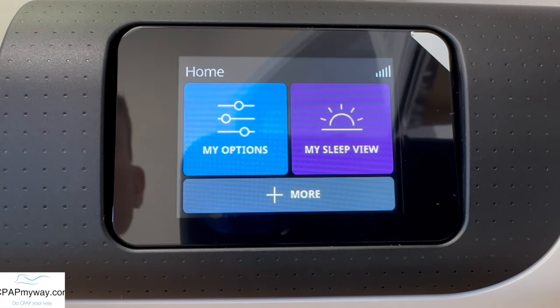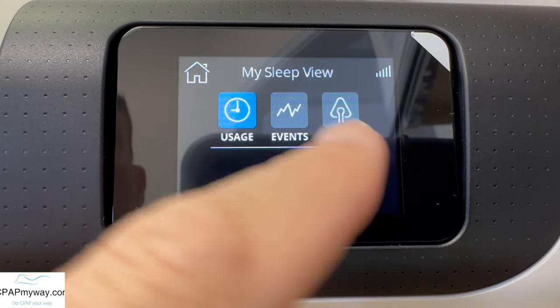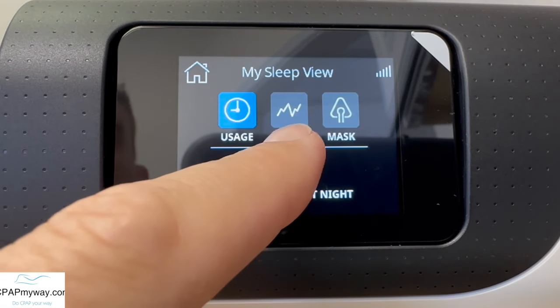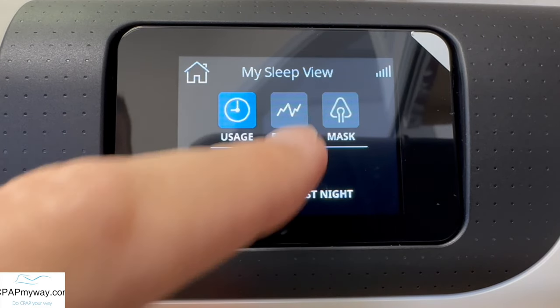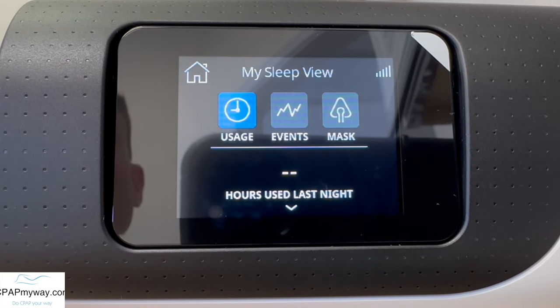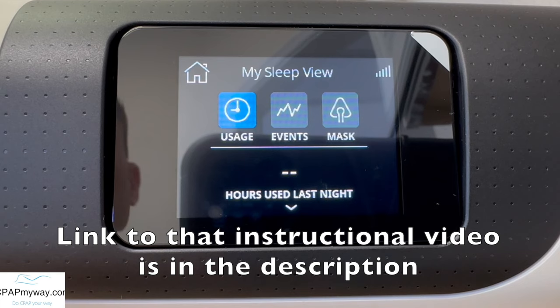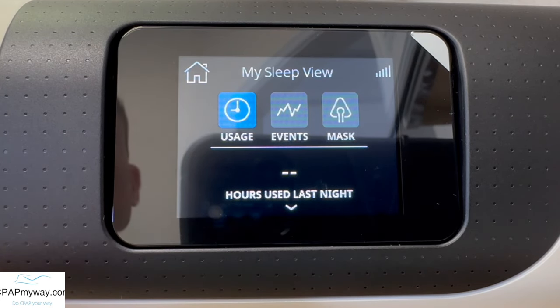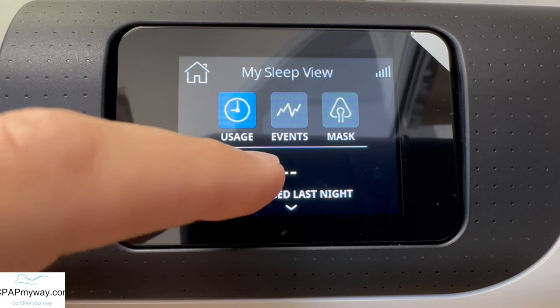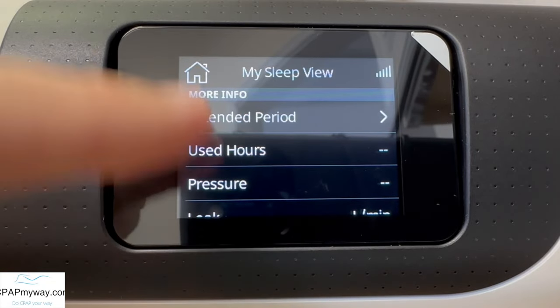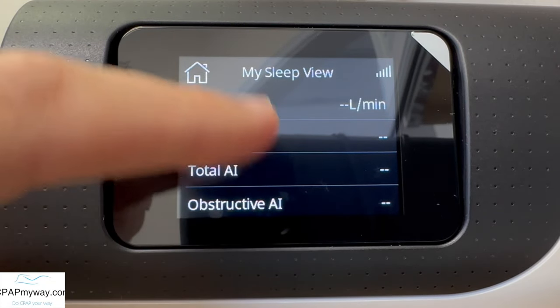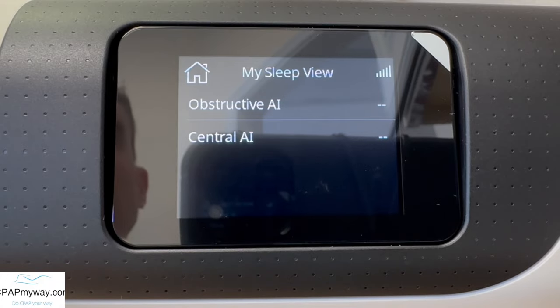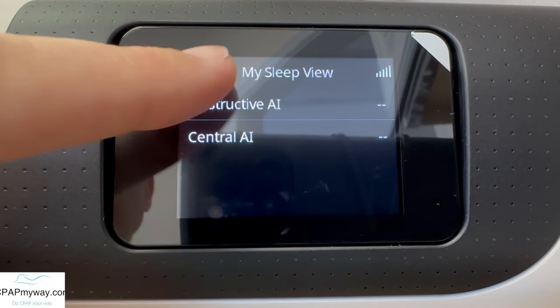That's it on your my options. In your my sleep view, you will see your usage, events, and mask selections. If you don't see the events, I'm going to put a link to the other video that'll help explain how to turn that on — you're in the simple view if that's the case. In here, you'll be able to see your usage information, your leak, apnea hypopnea index, obstructive apnea, central apnea, all those kinds of things.